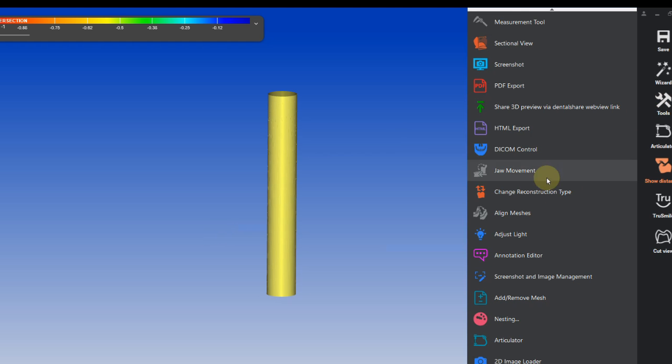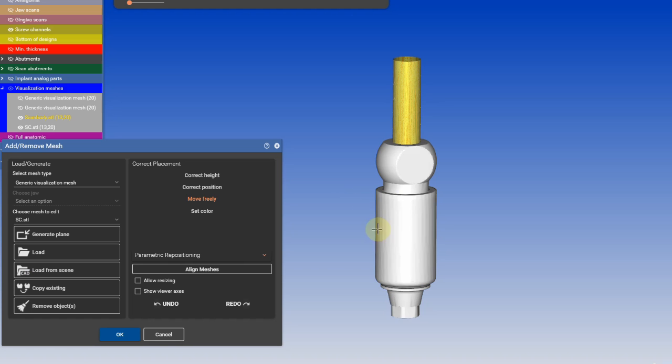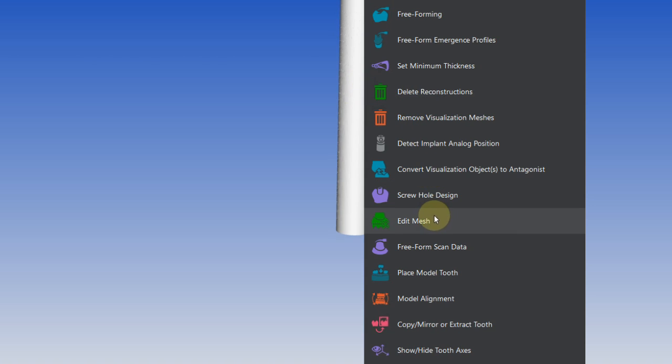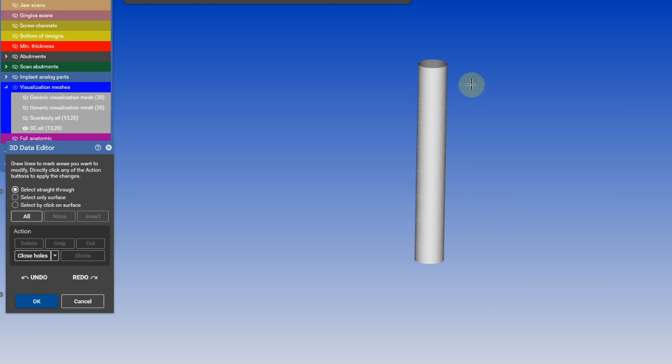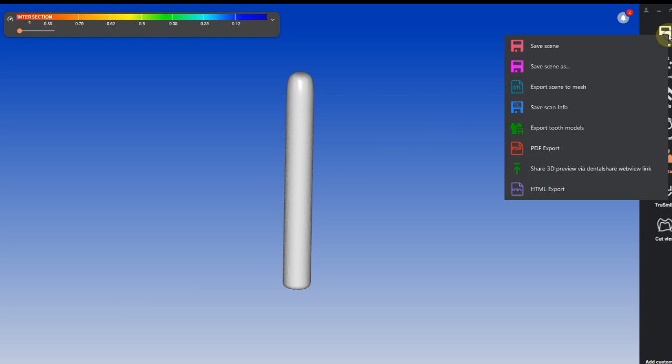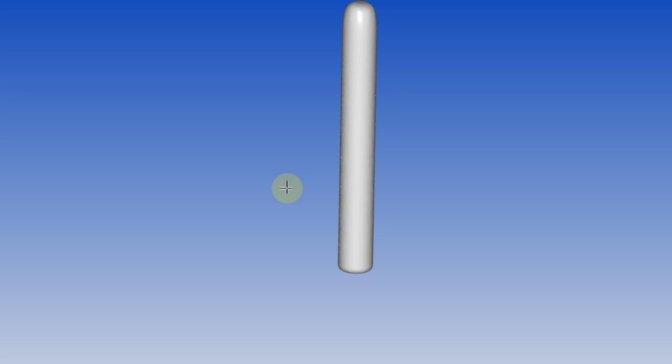To bypass it, we need to export our screw channel as a regular STL file. Then we're going to import it again under Add and Remove Mesh. We're going to select only the screw channel, right-click on it, edit mesh, select all, and close the holes. Now we're going to export it again as a regular STL.